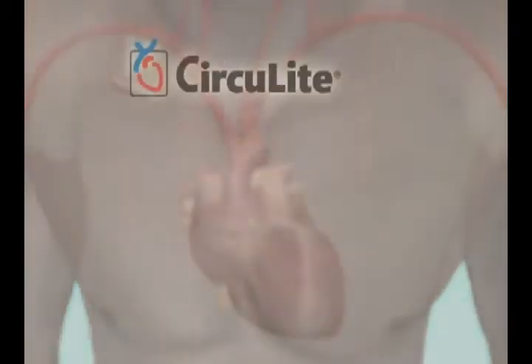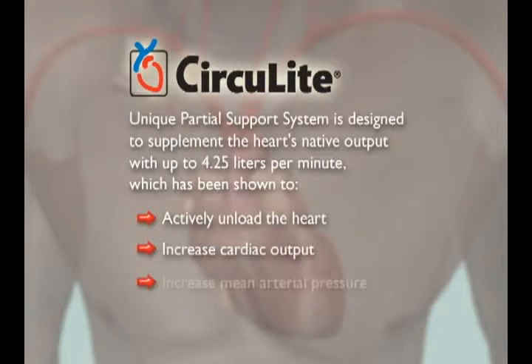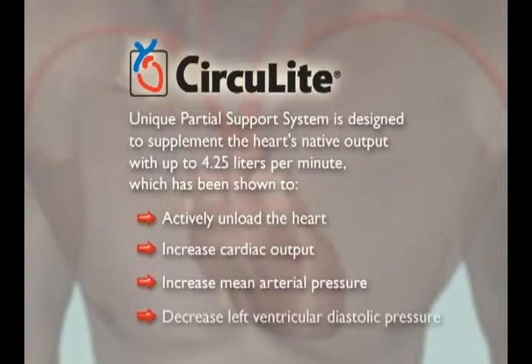Ongoing studies suggest that up to 4.25 liters per minute of partial support with Synergy increases total cardiac output and mean arterial pressure while decreasing left ventricular diastolic pressure, thus allowing the heart to rest and potentially enabling beneficial recovery.